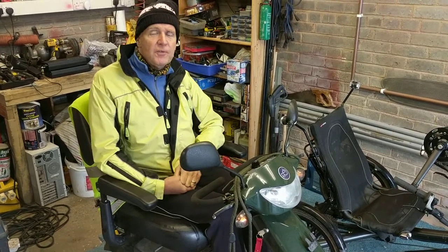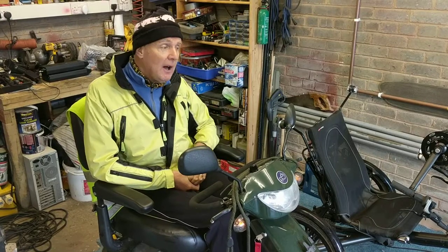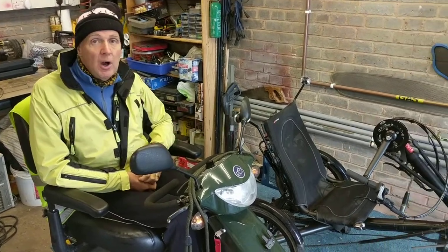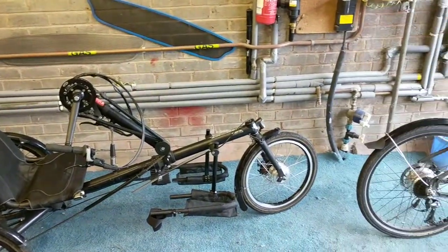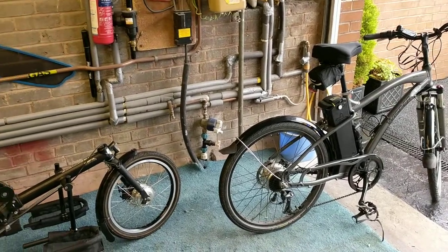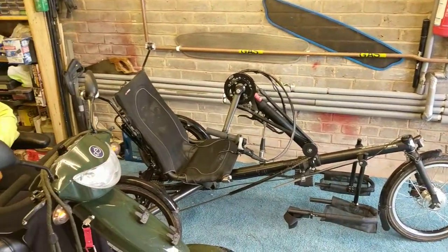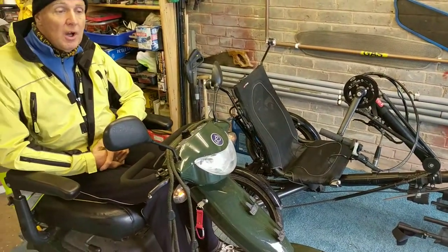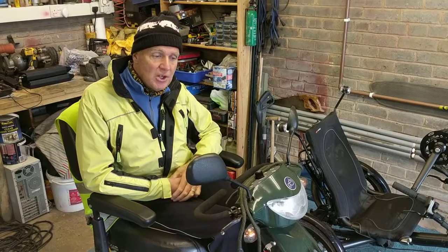Hello, this is the first day of the conversion of trying to get a Ketsweasel handbike into a bike train using the Whisper 905 Sport. The reason we're doing this is my condition which is secondary progressive MS. My right leg is failing to function and I'm struggling to use my trike and to get the rotation.